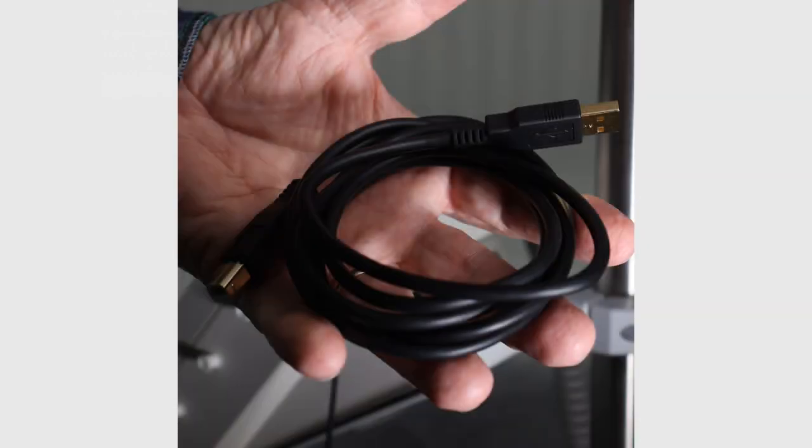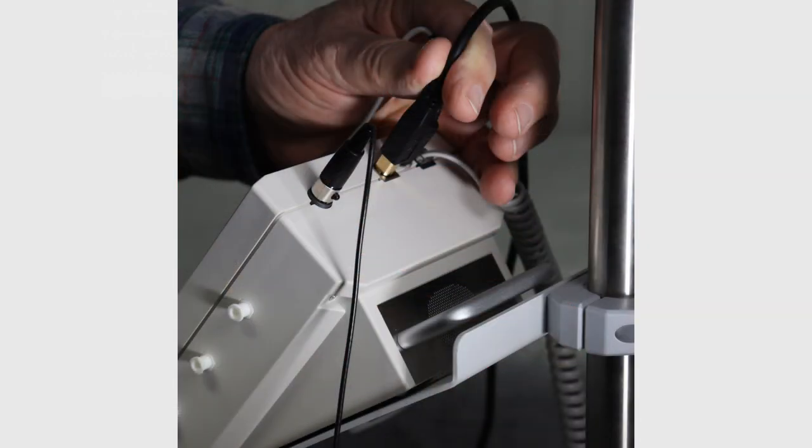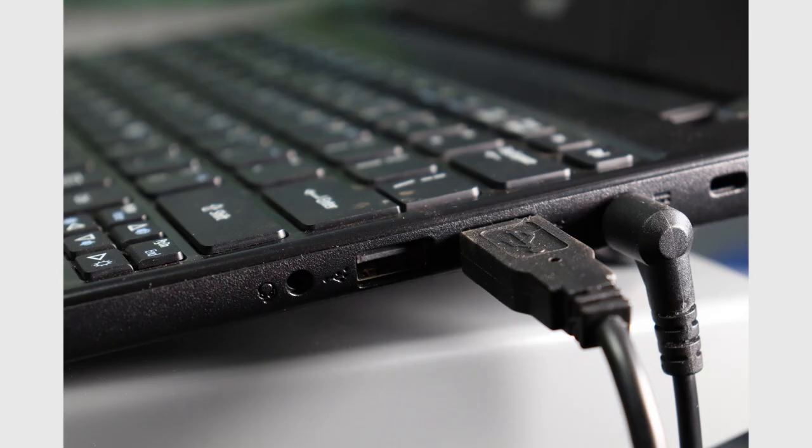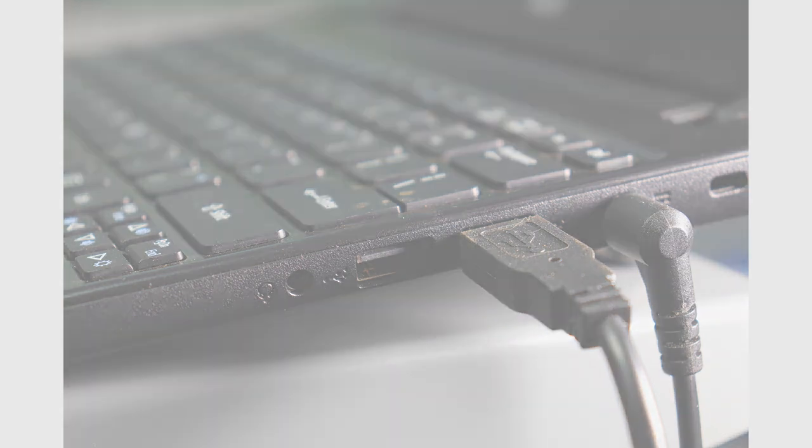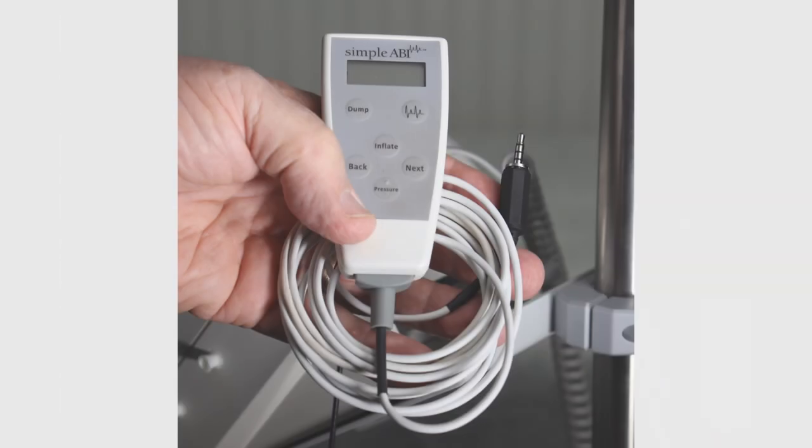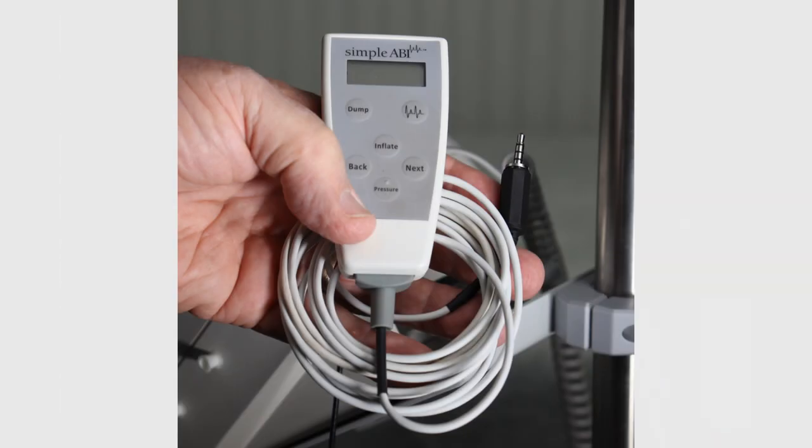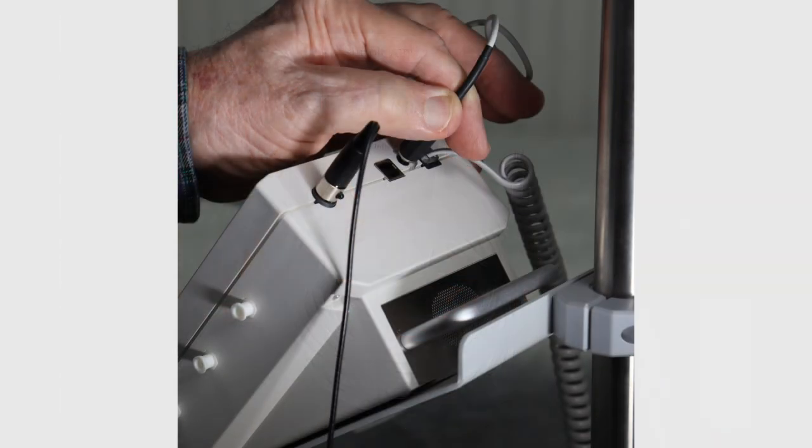Locate the USB cable. Connect the USB cable to the cufflink and the other end to the 3.0 USB connector in the computer. Locate the remote control for the cufflink and connect it to the cufflink.